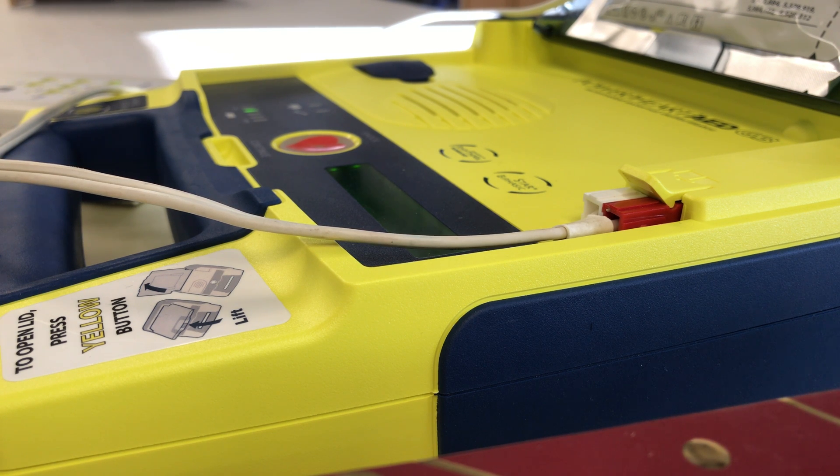Do not touch the patient. Analyzing heart rhythm. Please wait. Do not touch the patient. Analyzing heart rhythm. Please wait.